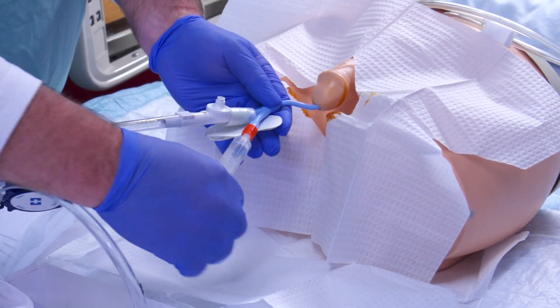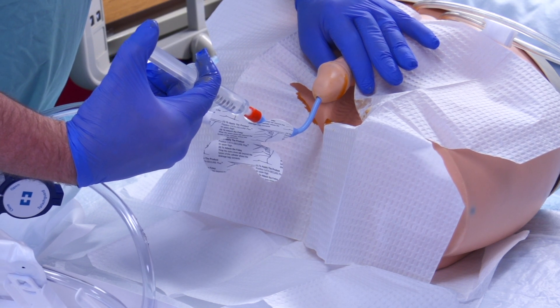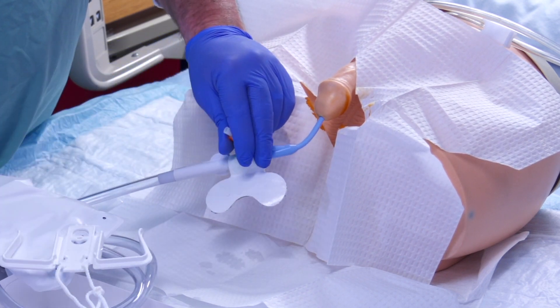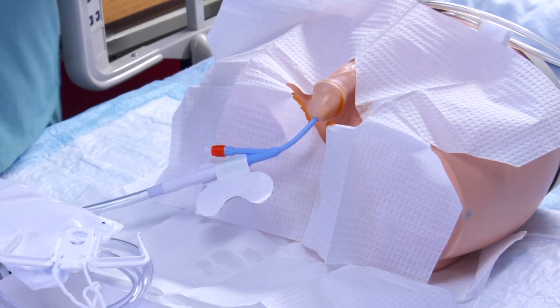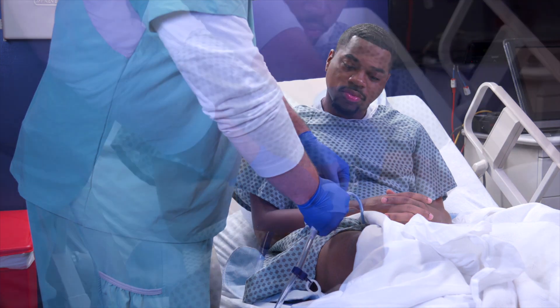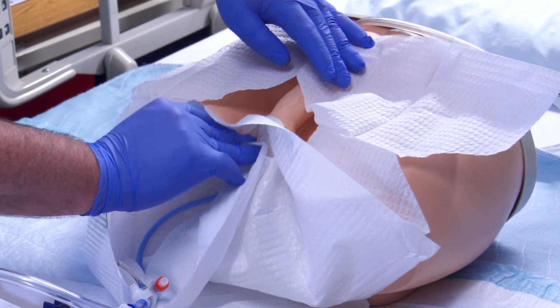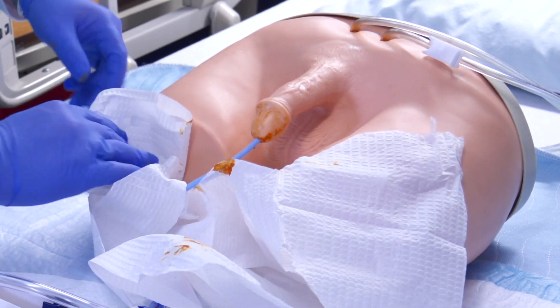Hold the catheter firmly in place while you inflate the balloon with the entire 10 milliliters of sterile water provided in the tray. Disconnect the syringe from the inflation port. Gently pull back on the catheter to ensure that it is in place against the bladder neck. Release your hand from the perineal area, hang the collection bag below the bladder level, and secure the catheter on the patient's upper thigh with a catheter securement device. Using the sterile drape, wipe the perineal area to remove excess lubricant and prepping solution using a front-to-back motion. Use a different part of the sterile drape for each motion.